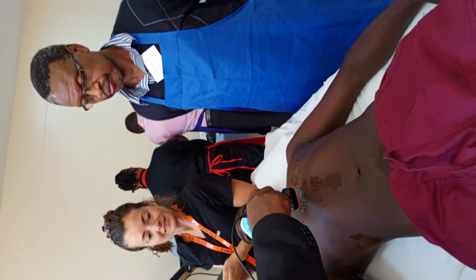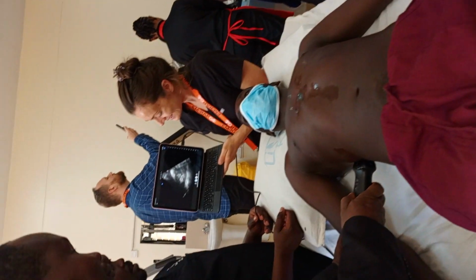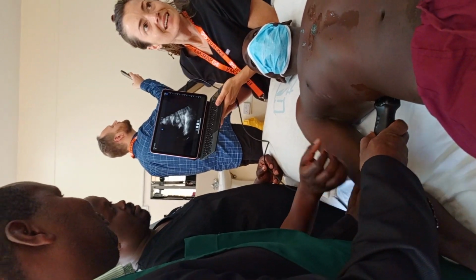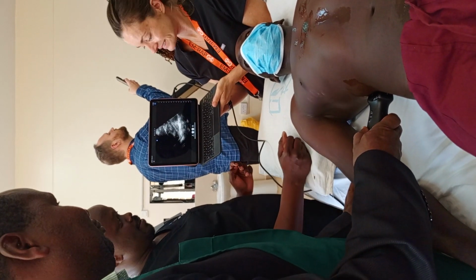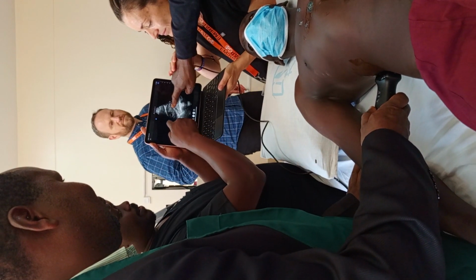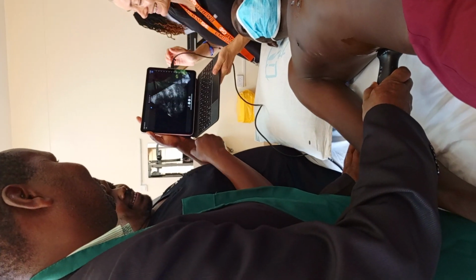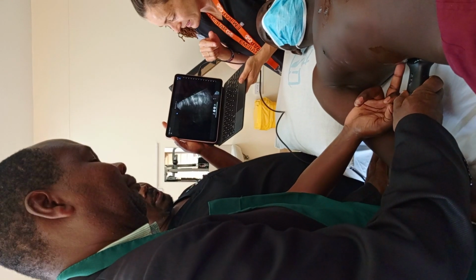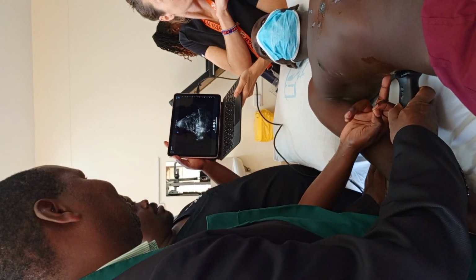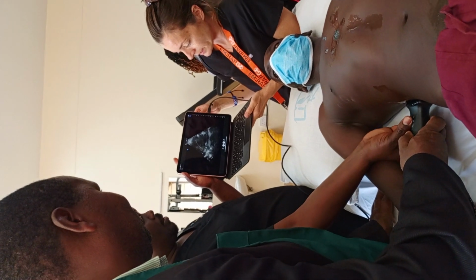Yeah, grab a little gel. All right. Does he have a good view? What do we think? Can you point to the kidney? And I didn't know if we said this, but when you're trying to push your needle, if you put a syringe, that whole thing right there. Okay, let's get a better view of the kidney for me. Could you point to the liver? Let's get a better view of everything.